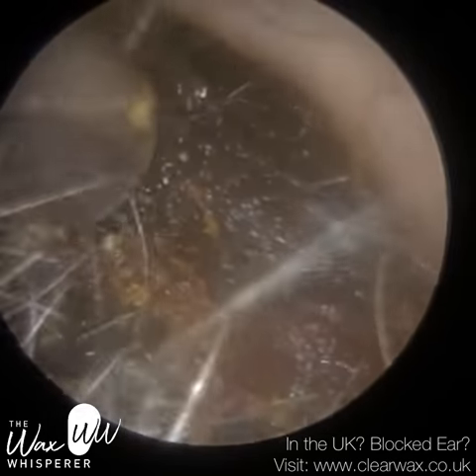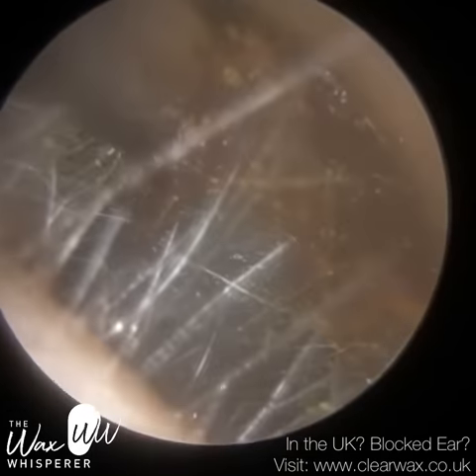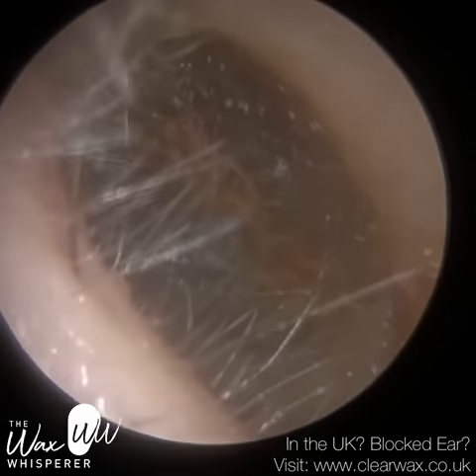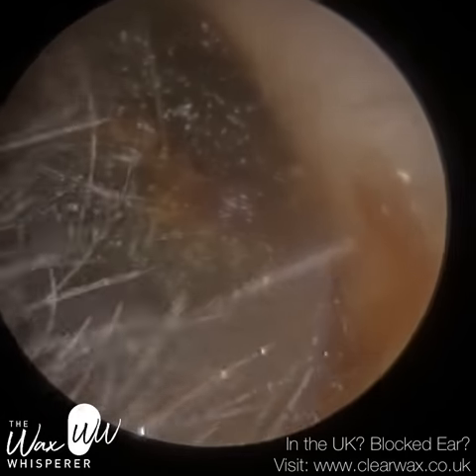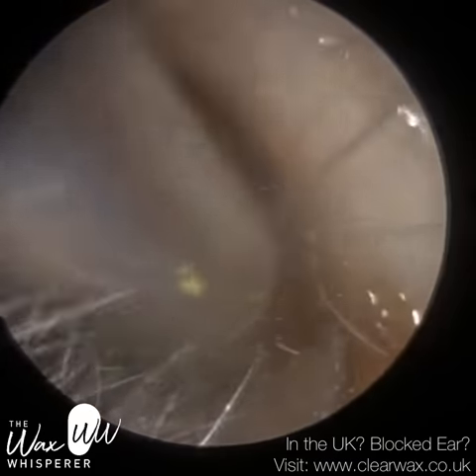I'll just try to show you the moment when the patient did — I think it was any moment now. And as you can see, we're not actually making contact with the canal wall. I think it was here where the patient reported it, so I stopped momentarily. And I just went back in to have a look to see what may have been causing that. I actually showed the patient the video back just to reassure them that we're not making contact with the ear canal or the eardrum.